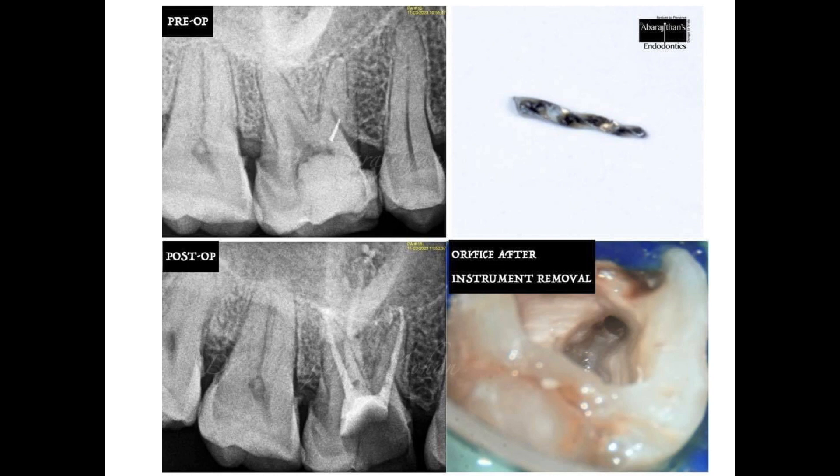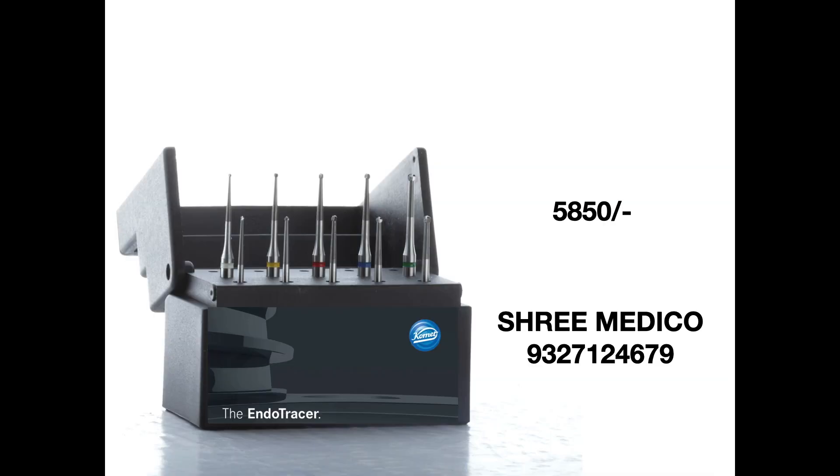You can see that in spite of using these long neck burs, I haven't literally gouged or removed excessive tooth structure at the orifice level, and we have not lost a lot of root dentin either. This particular product is available from Comet — the cost and dealer contact number are mentioned in the video. If you're interested to know more, we can do a product comparison of different long neck burs in the market in upcoming videos. Do let me know in the comment box. Thank you and see you all soon.